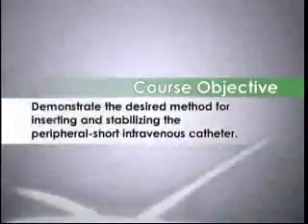When selecting a catheter, there are many things to consider. The selected catheter should fit the needs of the patient and be in concert with the intended prescribed therapy. Products manufactured by different companies have varying specifications and instructions for insertion and use. Always remember to use the smallest and shortest length catheter that will accommodate the prescribed therapy to allow for maximum blood flow around the catheter. It's essential that the nurse be familiar and skilled at the insertion techniques and procedures for the selected catheter.